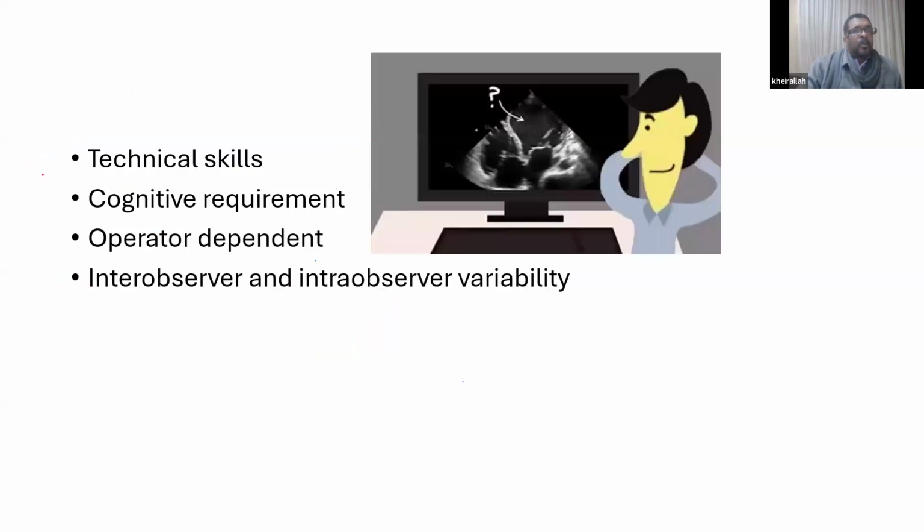For echo, you have to remember that you have to obtain technical skills. It's also important to know the science of echo, and it's very important to know that echo, as ultrasound in general, is operator dependent. So how you do it is make or break. فممكن تكون a good technician, have good technical skills, you get a better image than somebody who had poor technical skills. We also have inter-observer and intra-observer variability in looking at the images.